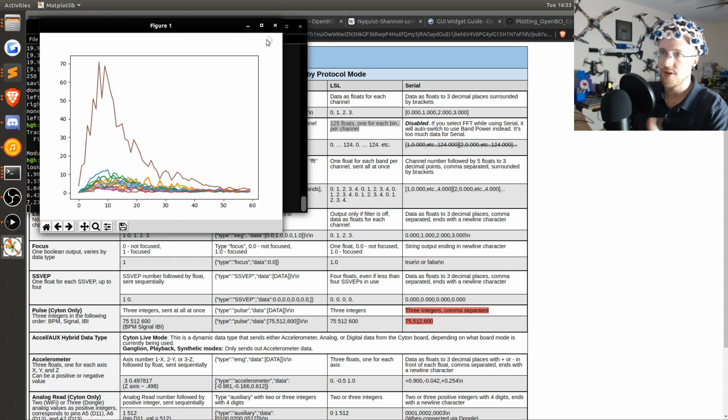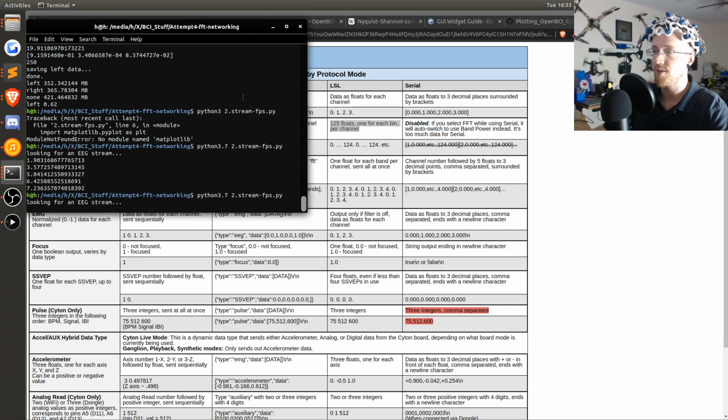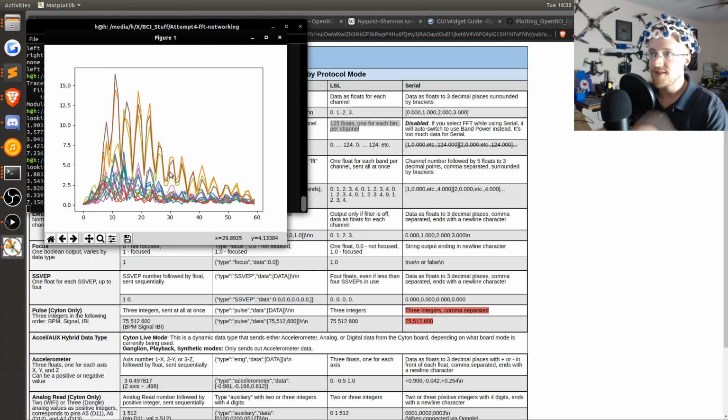Now, obviously, this is just a single frame. I'm probably moving my head, so we're seeing quite the fluctuation there. But anyway, yes, this is the data I was after. So now, finally, I've got that information.